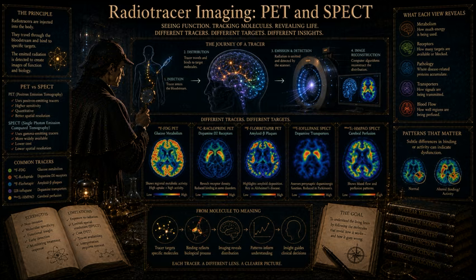What does that mean in the context of calculating safety? When you inject a radiotracer into the bloodstream, it doesn't just go to the brain. It circulates systemically. As the body metabolizes and attempts to excrete the foreign molecule, the radioactivity will pool in specific organs. If the tracer is highly water-soluble and clears through the renal system, it will concentrate in the urine, making the bladder wall the organ receiving the highest concentrated dose of radiation. If it is lipid-soluble and clears hepatically, it will pool in the liver or the gallbladder. So the critical organ is whatever organ takes the heaviest beating from that specific chemical.